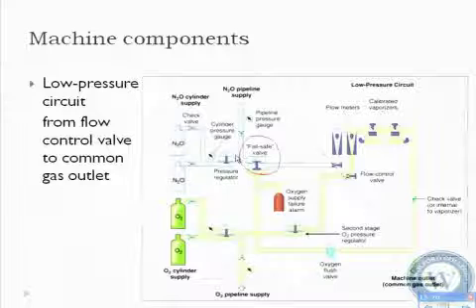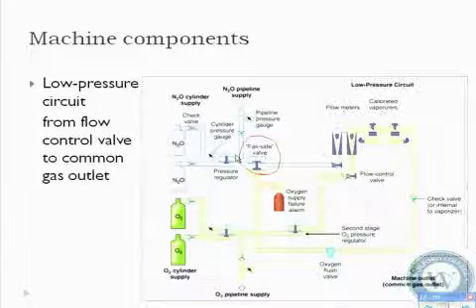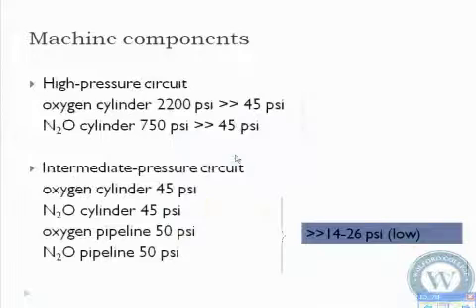Yep. So I just said that there was one, right? Anytime that you're reducing pressure from many hundreds of PSI, you do have to have 2. So I apologize. The first one is on the inside, and I actually just confused you with that. But I showed you on the cylinder that they have a pressure reducer just inside the check valve, right? So on every single cylinder, they have to reduce pressure immediately as it enters the system.